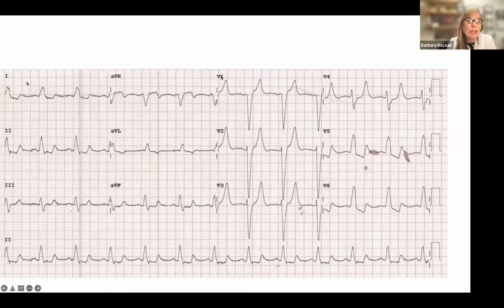Okay. Again, another patient here, upright in 1, upright in aVF. So I have a normal axis because I'm activating really from the right heart. And so I'm activating towards the apex and the base. And that's going to give me basically a normal axis. Sometimes it might give me a left axis, and that's okay too. But it's upright in 1 and upright in aVF. So I've got a normal axis.